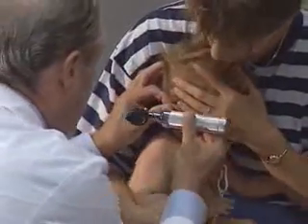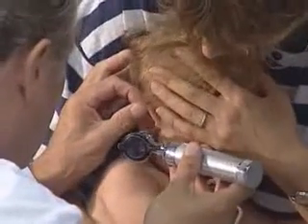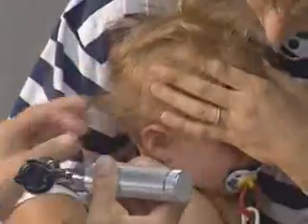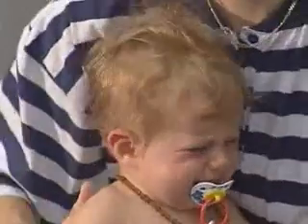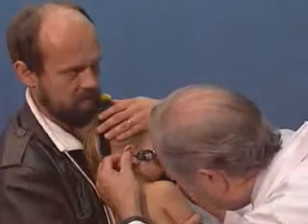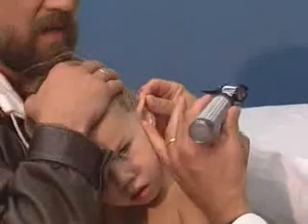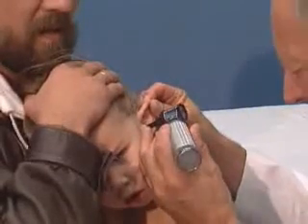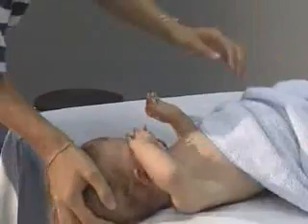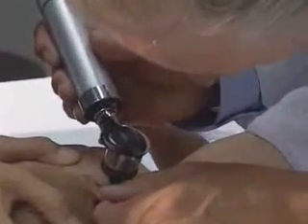The auditory canal and the tympanic membrane are inspected with the otoscope. The mother is asked to hold the child. This is not a popular examination and should therefore be carried out towards the end. The otoscope may be introduced only while checking visually, especially because the auditory canal is short in children. The hand which guides the otoscope must be propped against the child's head. If the child's head is well fixed, the examination may also be carried out in a lying position.